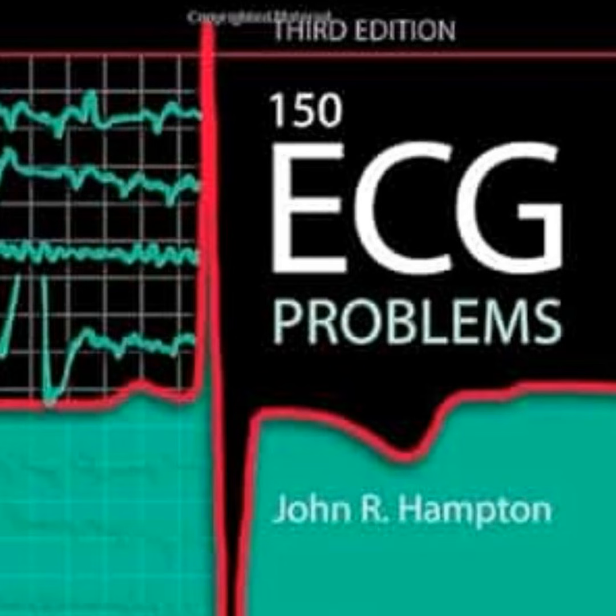So by recognizing that specific bifascicular pattern on the ECG, you can actually anticipate that total failure before it happens. That's the whole point. It prompts you to prepare for transcutaneous pacing or get cardiology involved immediately. You are treating the trajectory of the disease, not just the rhythm you see in that exact moment. Man, the conduction system is just fascinating.